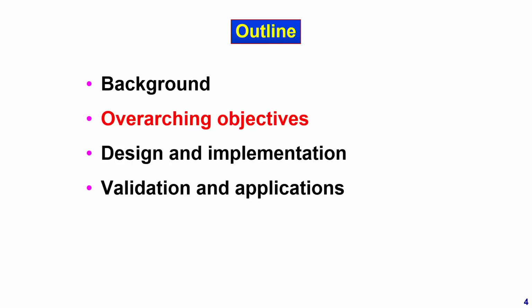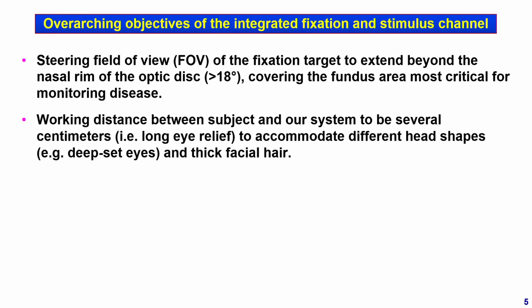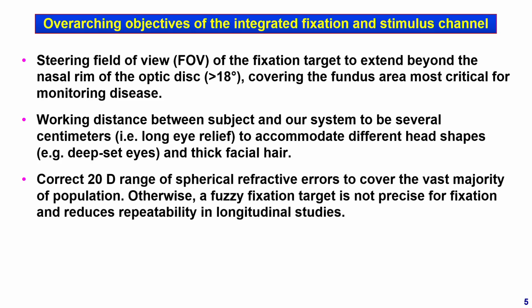We have several overarching objectives of the fixation and stimulus channel. We want the steering field of view of the fixation target to extend beyond the nasal rim of the optic disc, covering the fundus area most critical for monitoring disease. We want the working distance between subject and our system to be several centimeters to accommodate different head shapes and thick facial hair.